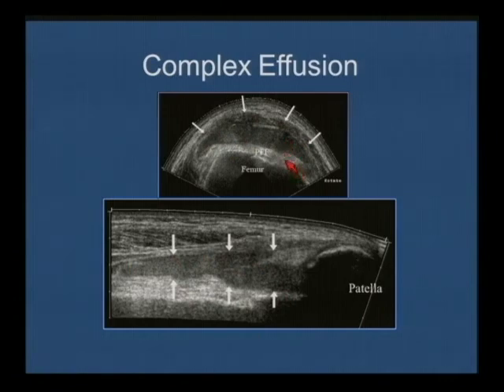In terms of evaluating fluid, remember that in the setting of infection, whether fluid is infected or not cannot be determined by ultrasound criteria. So, I mean, this looks like it's complex. Is this infected? It could be.